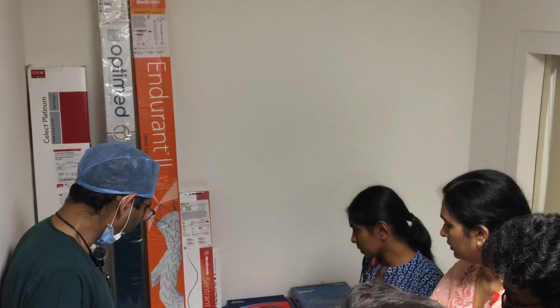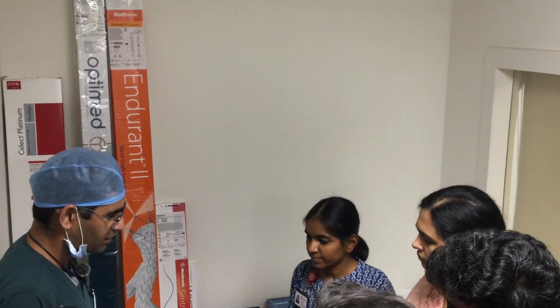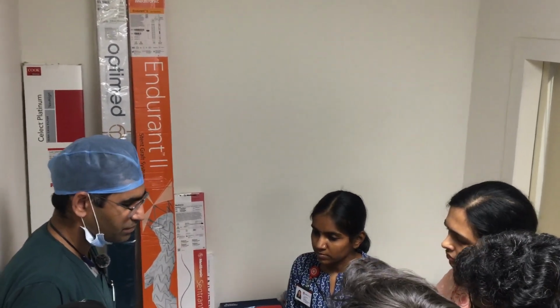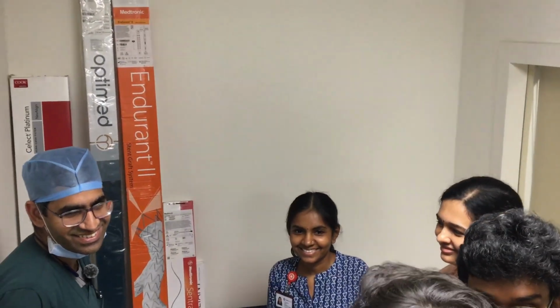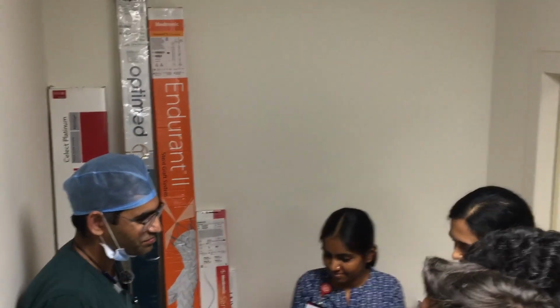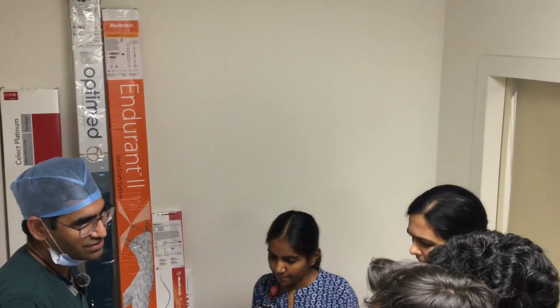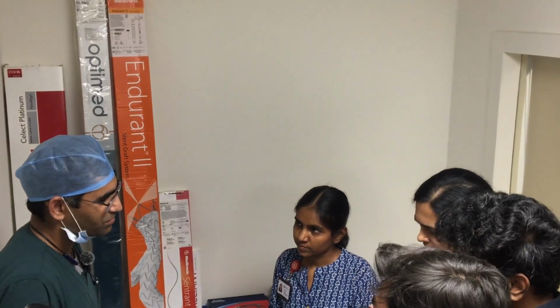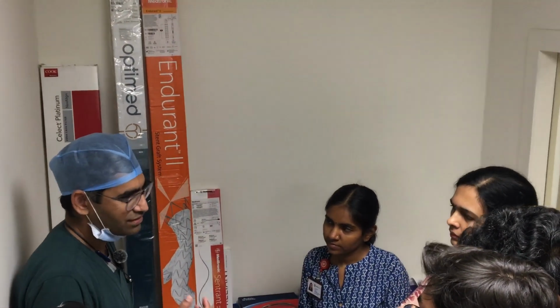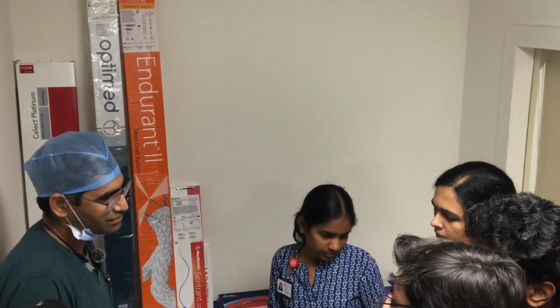Here, what we have is these are micro catheters. Basically, for any intervention, we need to reach the site of pathology. It may be anywhere. To reach there, previously, maybe 20 years back, there were only main catheters, big catheters.